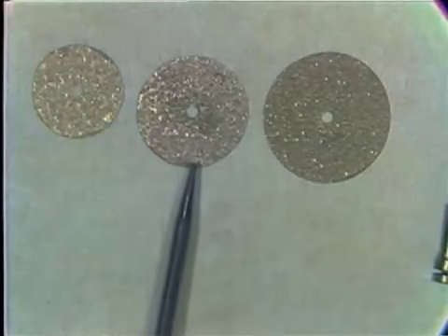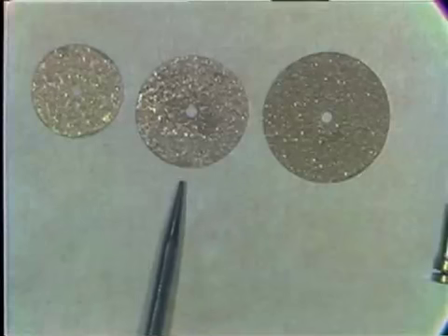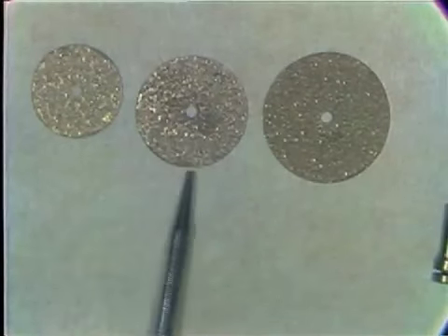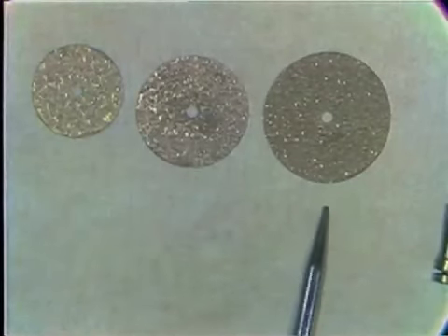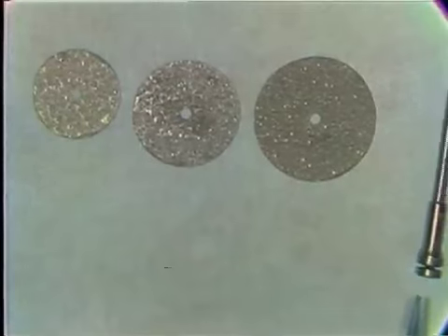The 3/4 inch disc is used when the tooth is relatively long, and of course the 5/8 is too small to get into it. The 7/8 inch disc, which we see many people using, is not utilized in a modified slice preparation. We will now go to the mandrels.